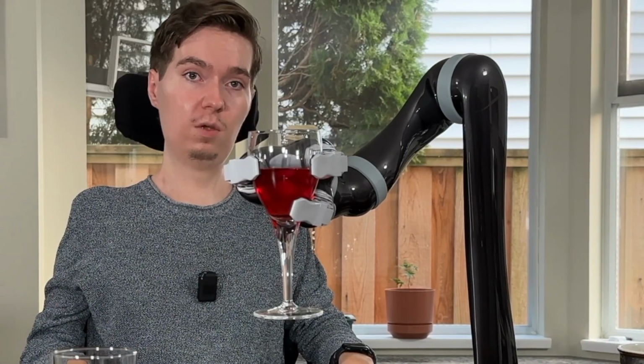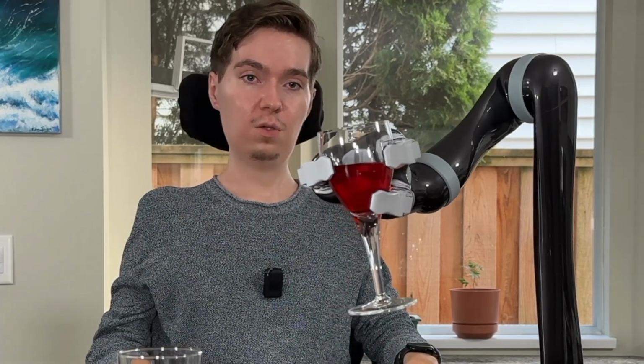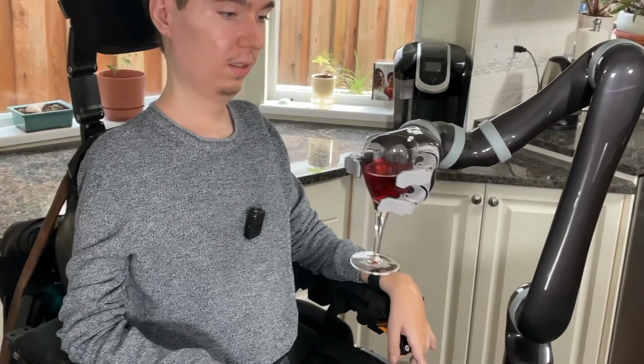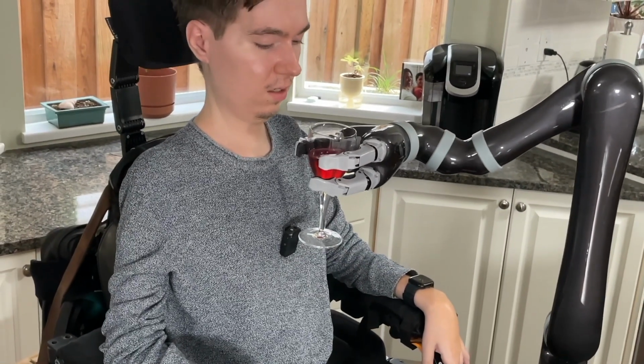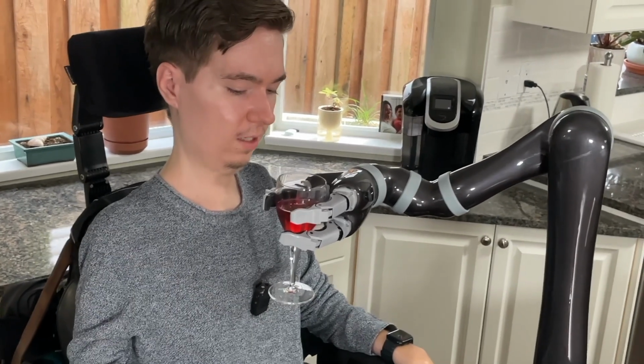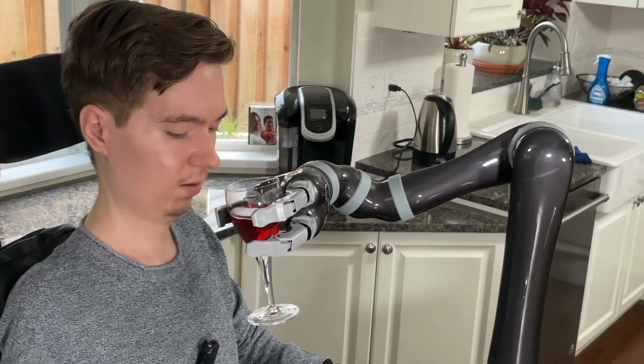So now I'm doing drinking mode, and again I'm going to rotate the wrist, but it's going to behave a little bit differently. You can see it's doing a more natural hand movement, which is going to facilitate drinking a little bit better. It's both rotating and lifting at the same time, and this is going to work a lot better if you're drinking straight from your cup. So now let's try it. Again, I'm going to bring it right up to my mouth, and I know it's already lined up nicely here. I might just turn it a little bit in B3 so that everything's lined up nicely. And then we're going to lift a little bit, and we're going to start trying to take our drink.